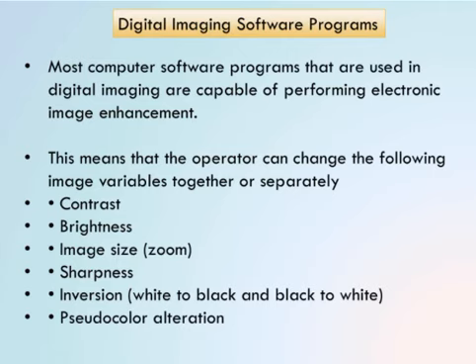Okay, so most computer software programs are capable of performing electronic image enhancements. What do you mean by that? Image enhancement. Enhancement means to increase, to make it better. So image enhancement means to make the image better.